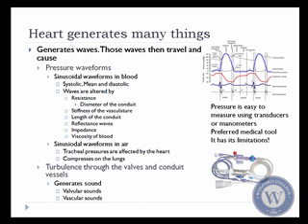In reality, these inferred pressures are telling you, to a certain degree, how much volume is being displaced. But the actual volume displaced has to do with possible effects of compliances of the actual structures, or alterations in resistance, or alterations in the length, reflectance waves. So all these are important factors when you're looking at overall pressure waveforms.